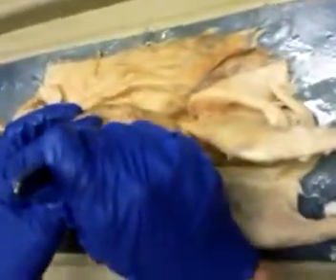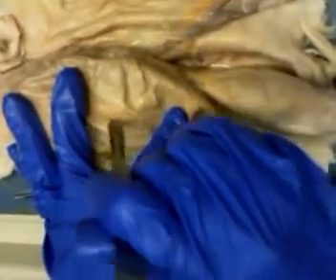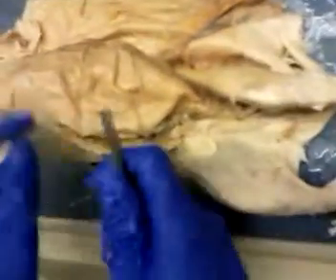So let's see. I'm going to cut this way first. And then I'll cut from that. Doing very shallow cuts here. Make sure your scalpel is sharpened. And this is to reveal what? 3 layers of muscle.